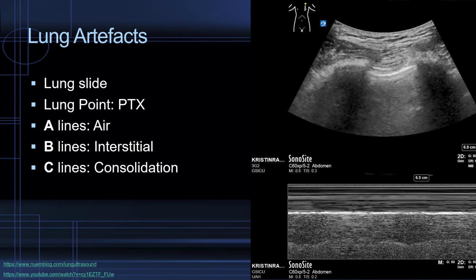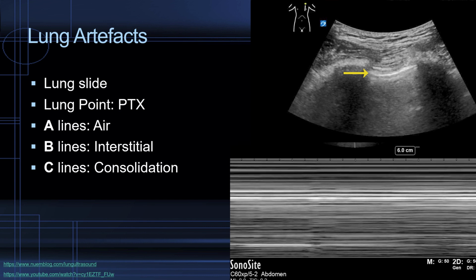In any lung ultrasound, the first thing you look for is lung slide, by the shimmer at the pleural line or seashore sign in M mode. Presence confirms ventilation in that section of lung. Absence could be pneumothorax with a barcode sign. It could be pleural adhesions and inflammation due to ARDS or pneumonia, or it could simply be a lack of ventilation, such as in a mucus plug.